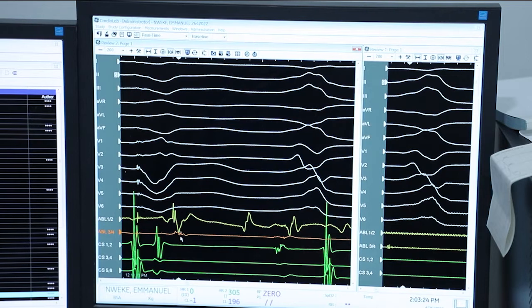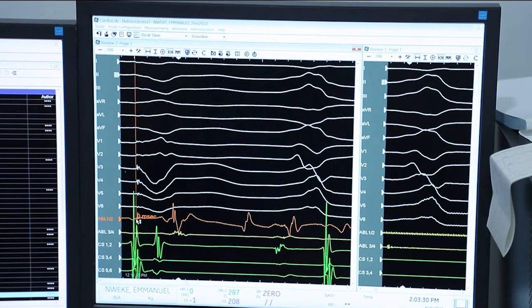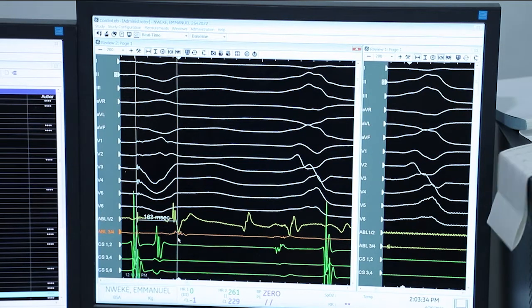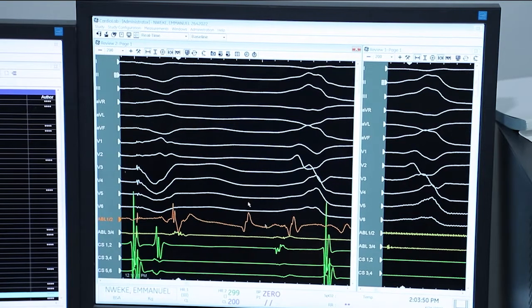We could get it from the endocardial side of the LV summit. Clearly it is very late. This is the QRS complex, and definitely we are late. But during PVCs, it has this fractionated component divided into 2 components, one which is early and the second is late, and also this is a very good site for ablation.